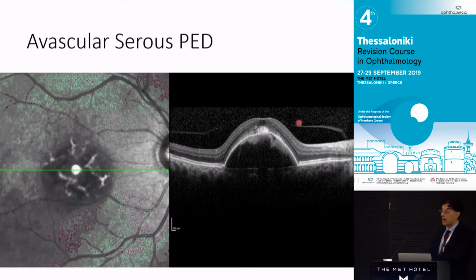So another thing that can end up in the injection clinics. In Moorfields we have pooled injection clinics where we have nurse injectors and paramedical staff who help in the retreatment decisions. The problem is if you get it wrong as they go in, they can get injected for a long time before you realize they may have this, which is a serous PED.